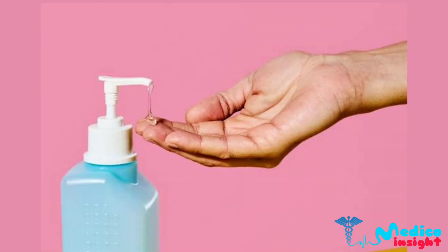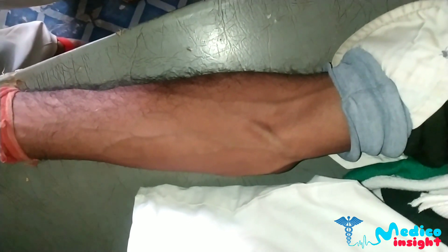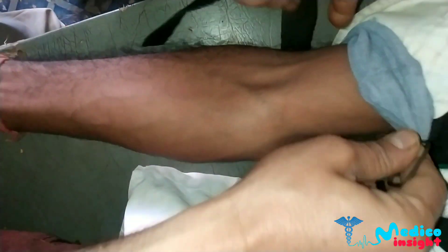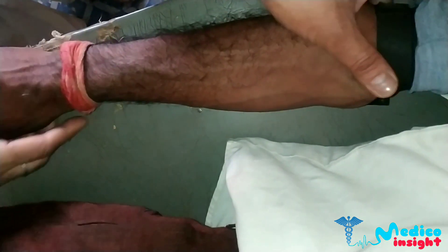First of all, sanitize your hands with alcohol cleanser. Position the arm so that it is comfortable for the patient and identify a vein. Then apply the tourniquet — as we can see, the tourniquet is applied. Then recheck the vein.